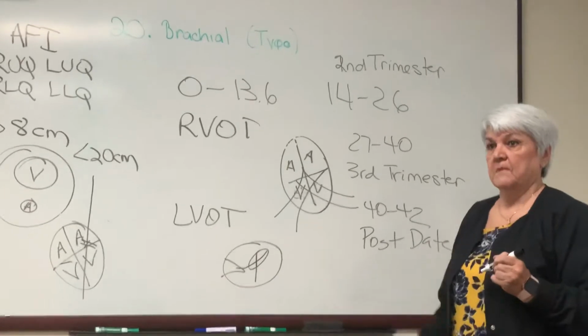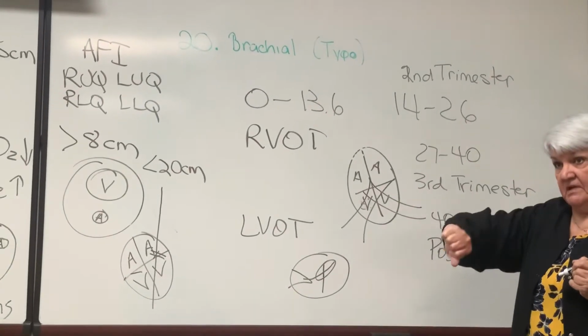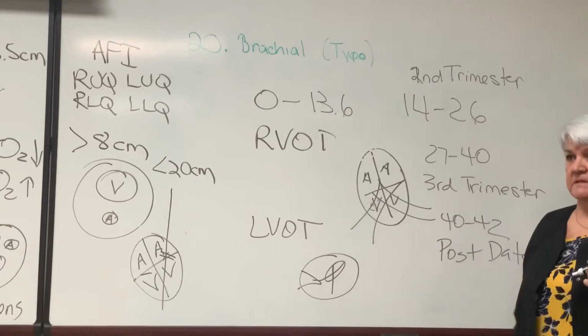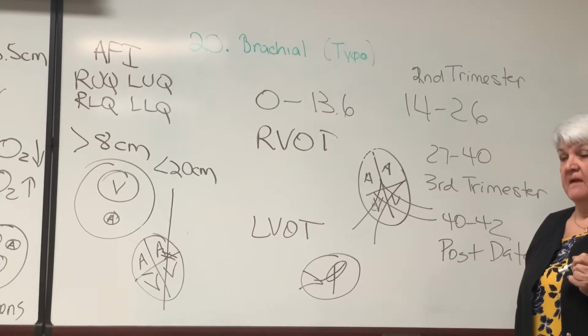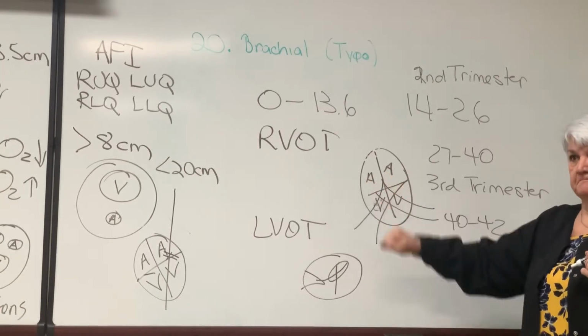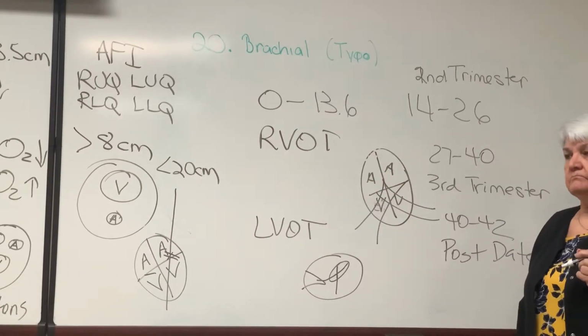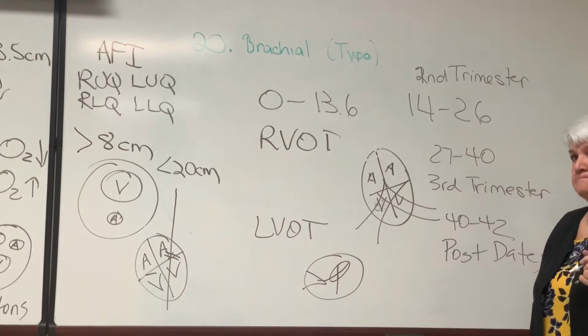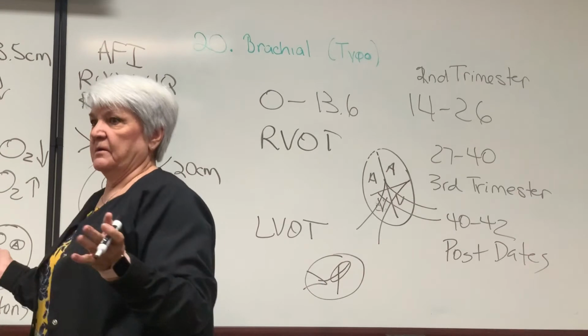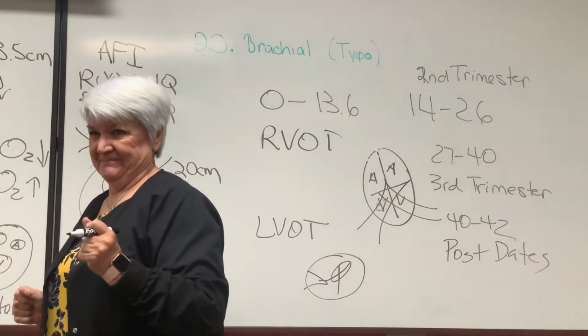You're just pivoting? Pivoting. Okay, I'm clockwise, counterclockwise. If I get lost, I go back to my 4-chamber heart. Okay, and those are the views, and now we have to do extremities.